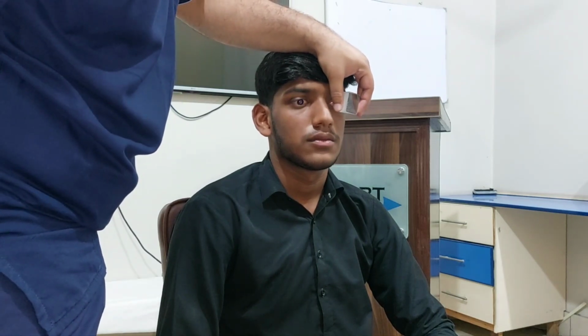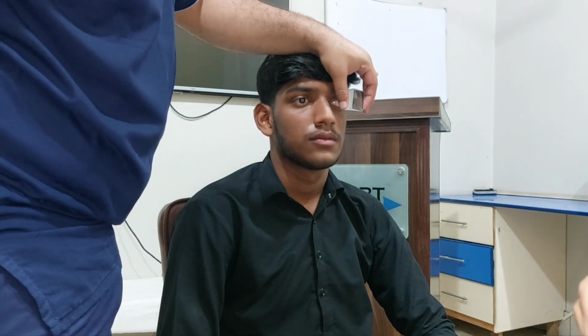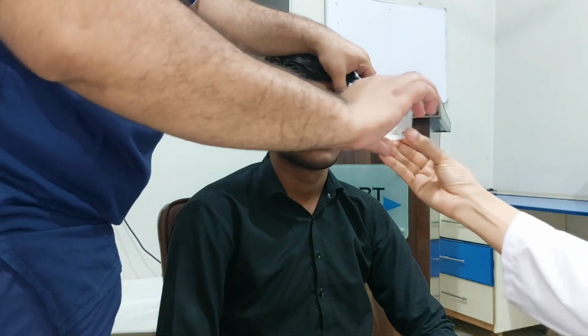Sir, in the other eye. Sir, where should I place it? Okay.